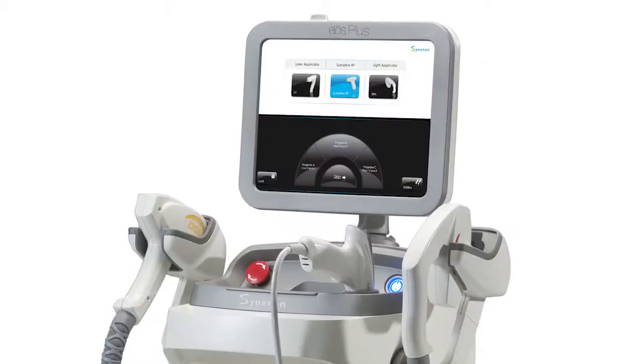My name is Michael Gold. I'm a dermatologist in Nashville, Tennessee. ELOS Plus is a platform created by Syneron Candela. In order to understand the ELOS Plus, you've got to understand a little bit about ELOS, which uses electrical optical energy and radio frequency together. The advantage of that is the RF energy allows us to use less optical energy — we don't have to use as much power on the optical side because we're adding in some radio frequency.